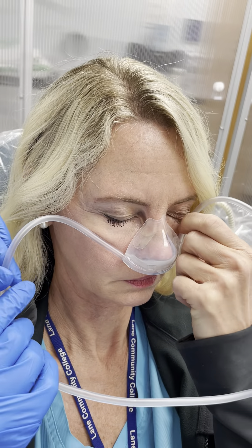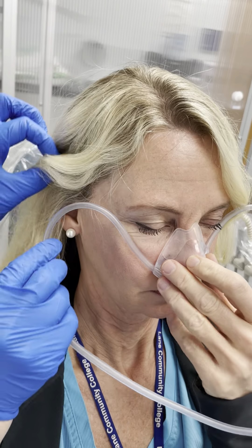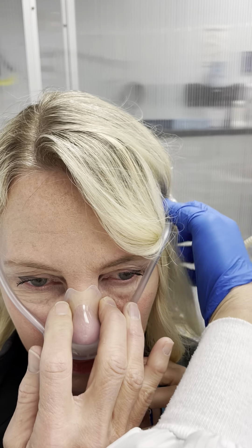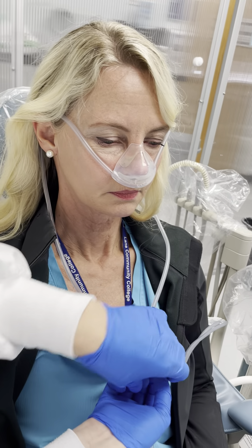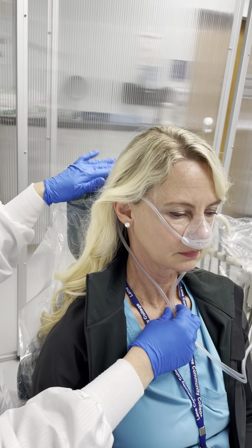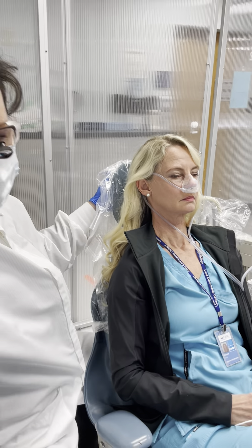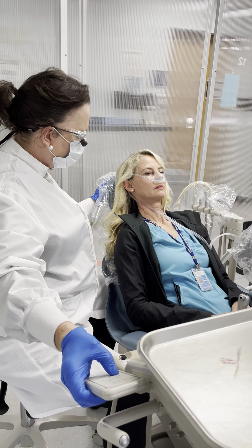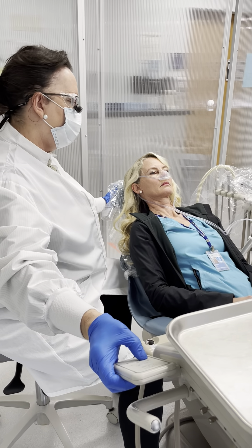Take your fingers and do a little squeeze to seal the mask. The ends go over their ears on each side. You can rub it on your nose to kind of tighten it. Once you've got it over their ears, slide up the little ring — like a bow tie — just under their chin, not too tight, because once you recline them back you don't want it to choke the patient. The mask should be up against the bottom of the nose, not hanging down on the lip.